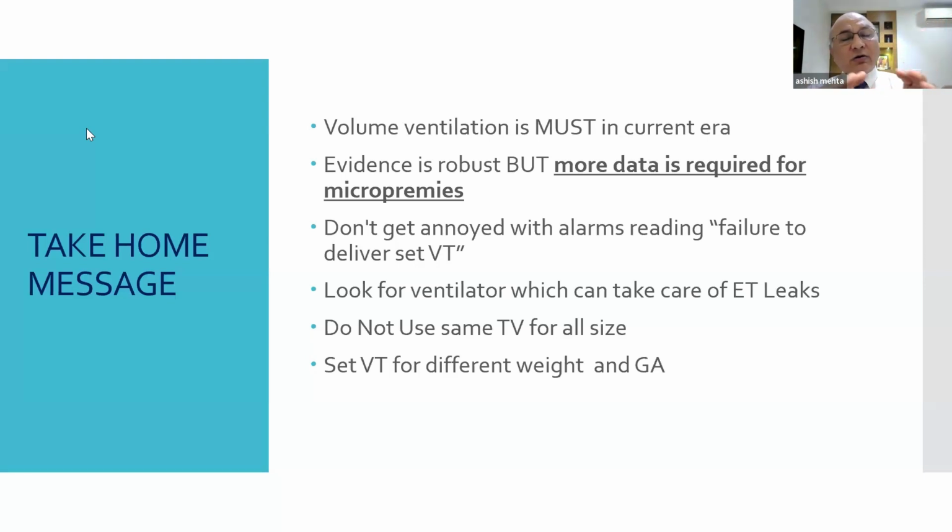In units like ours, where you have proper monitoring all the time, this ventilator will do good for our babies. But in places where things are not available and it is not possible to monitor, it is better to stick to the basics. That is the thing I wanted to highlight. Please stick to the basics, whatever you are doing with experience, but have a look at the delivered tidal volume. You may not target or guarantee, but you should keep monitoring how much volume is being delivered so that you can change your pressures.